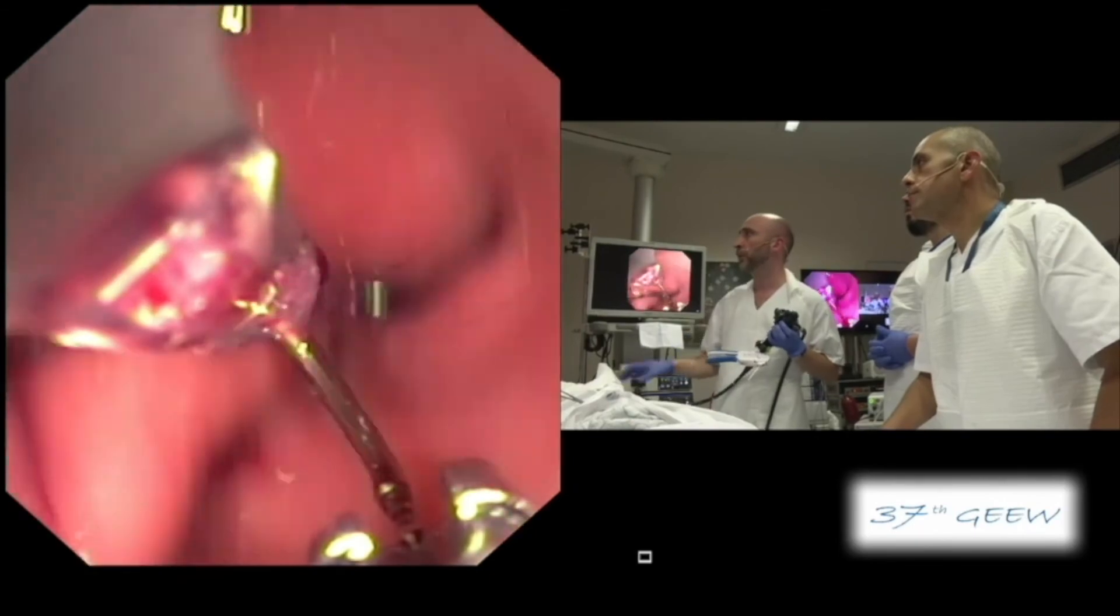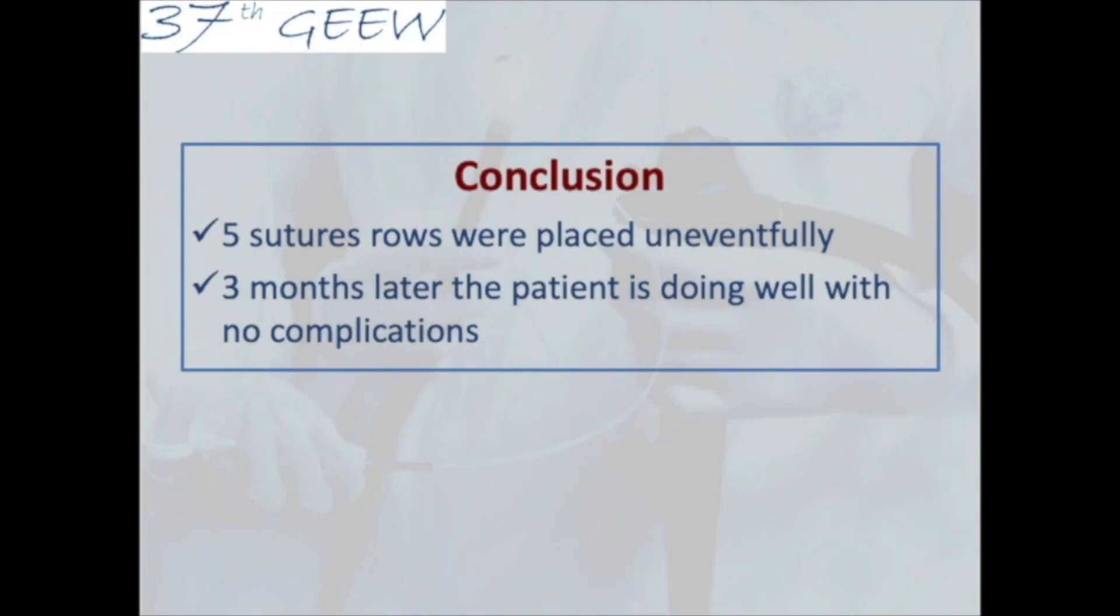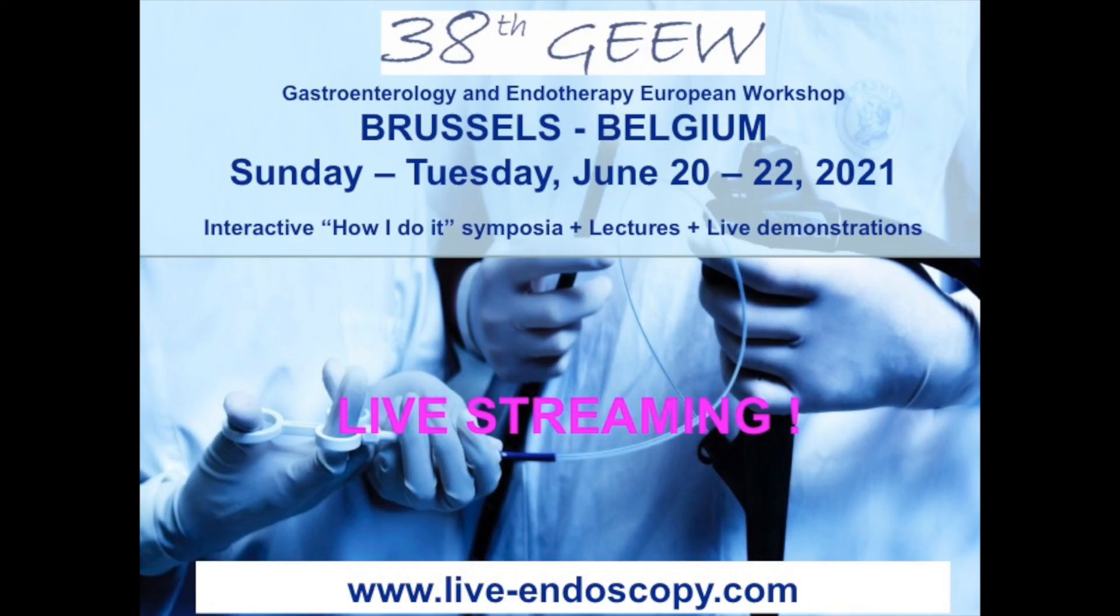So here we will now do normal gastroscopy just to see how is this side here. I think that is better.